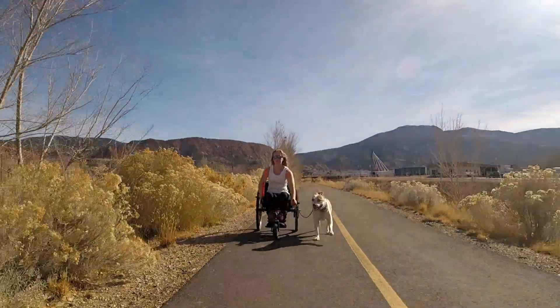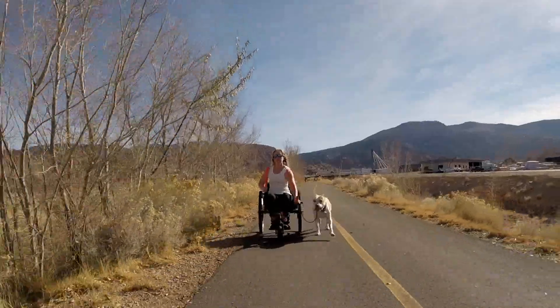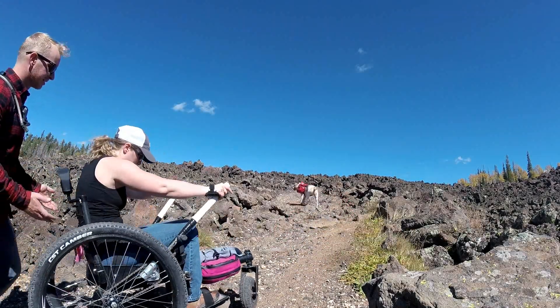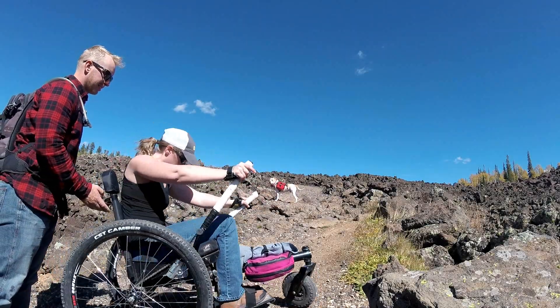You shift gears simply by moving your hands up and down the levers. Down close to the tires is the higher gear, allowing you to move quickly over smooth, flat terrain. Up at the top of the levers is a lower gear, allowing you to slowly maneuver over rough obstacles or ease up a challenging incline.